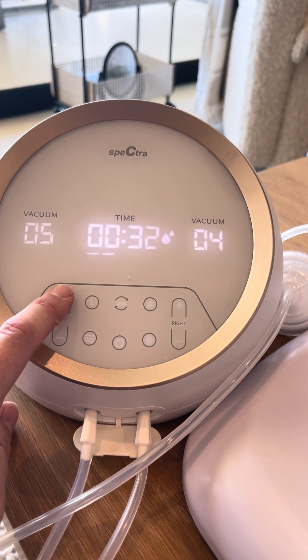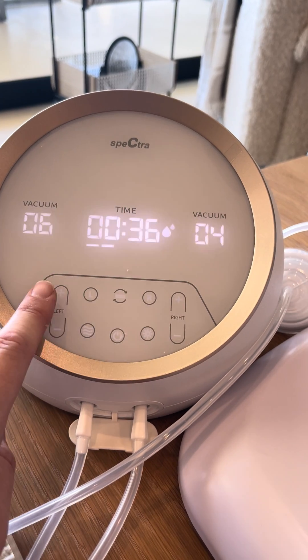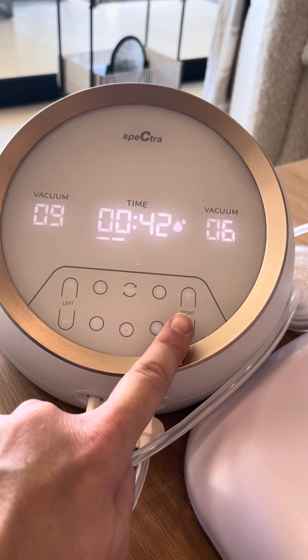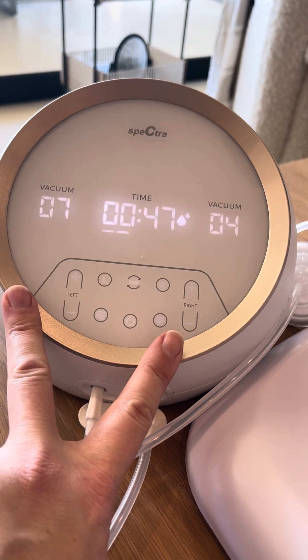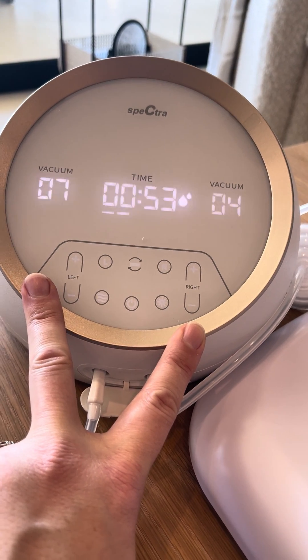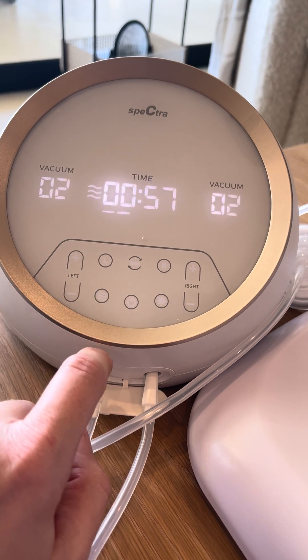You can change how hard it sucks — you can turn one side off or on, or you can turn it down while you're pumping. The nice thing about this pump is left and right both have their own motor, and they both have their own control for how hard it sucks. You can change it by doing those buttons.